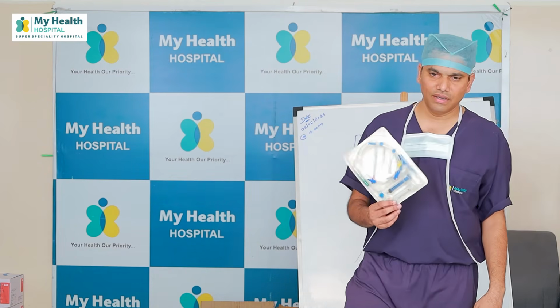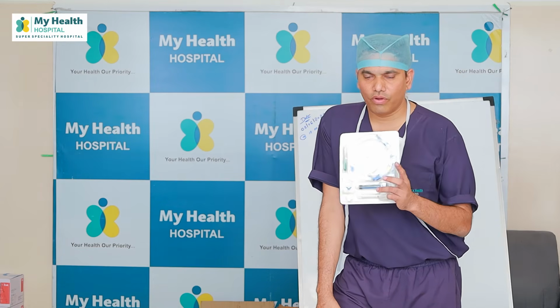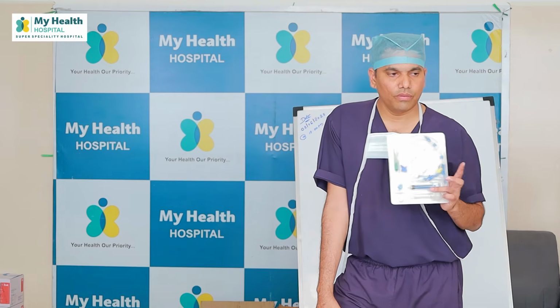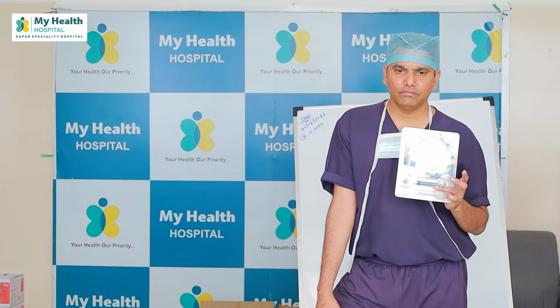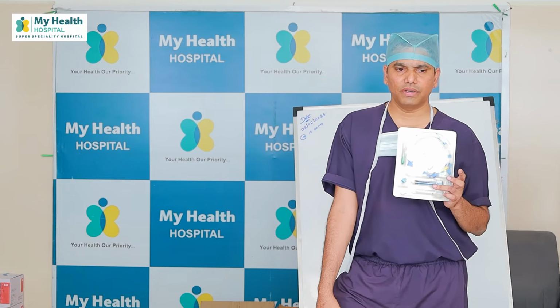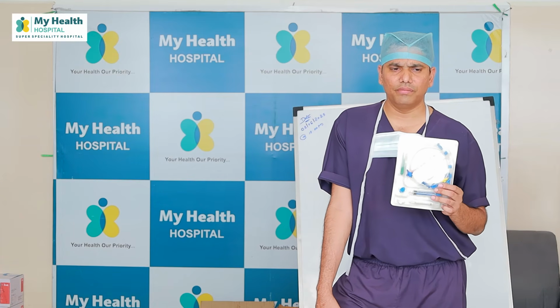What do we call this? Central line. Between triple lumen and double lumen, what do we use double lumen for? Dialysis sheath is separate. Where do you use double lumen?